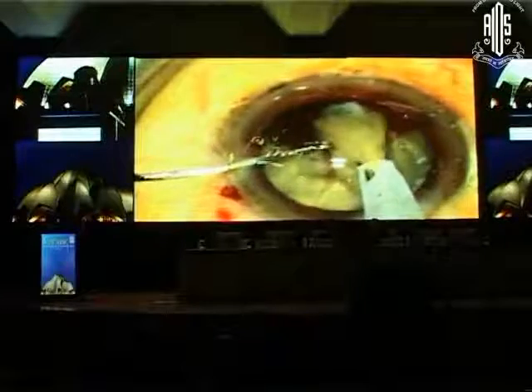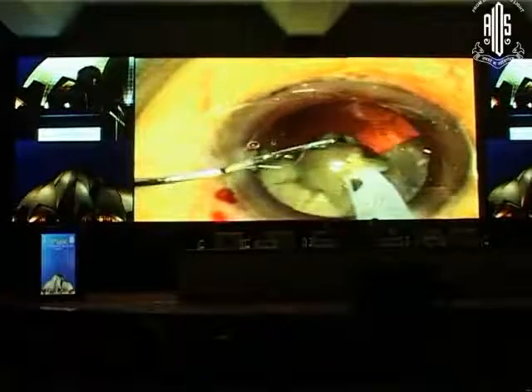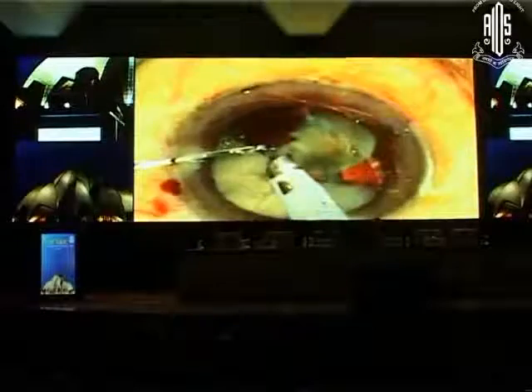So you now have one piece. You know all the pieces are separate. In stop and chop, you make 4 pieces. But when the nucleus is hard and bulky, then you make more than 4 pieces. It is so simple, because then you get smaller pieces which can be occluded by the phaco tip and emulsified.